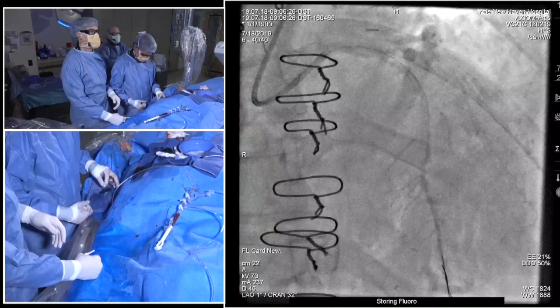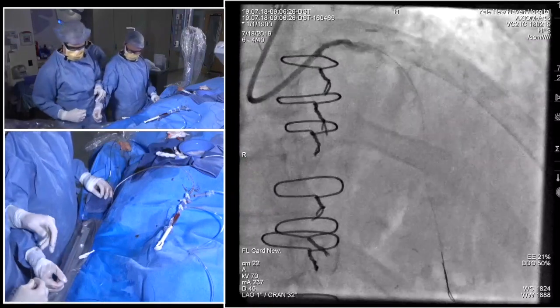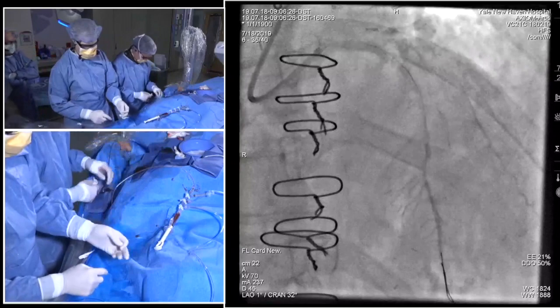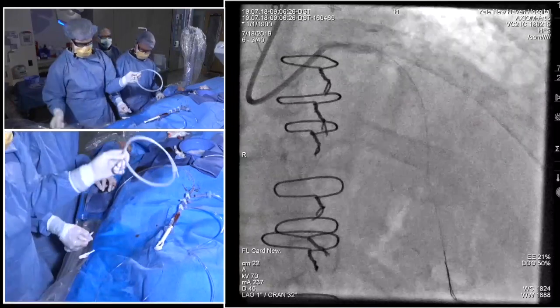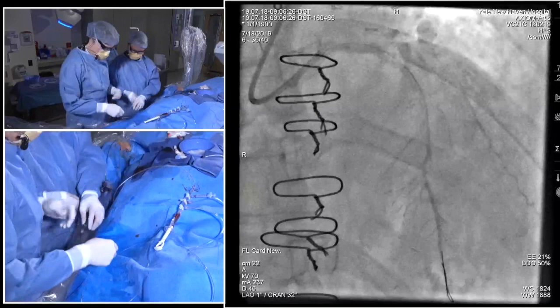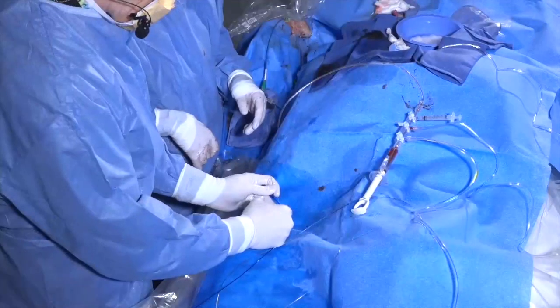The one challenge with imaging catheters and an HD catheter in particular is that there are more blood pooling artifacts. So if you take an HD IVUS down and the vessel flow isn't great, then it's sometimes hard to appreciate the difference between the artifact of the imaging, of the flow, versus where everything else is. But you probably have enough flow at this point to sort it out. The other thing, because you have good or better distal flow, is you could balloon first and then image afterwards, but either approach is fine.